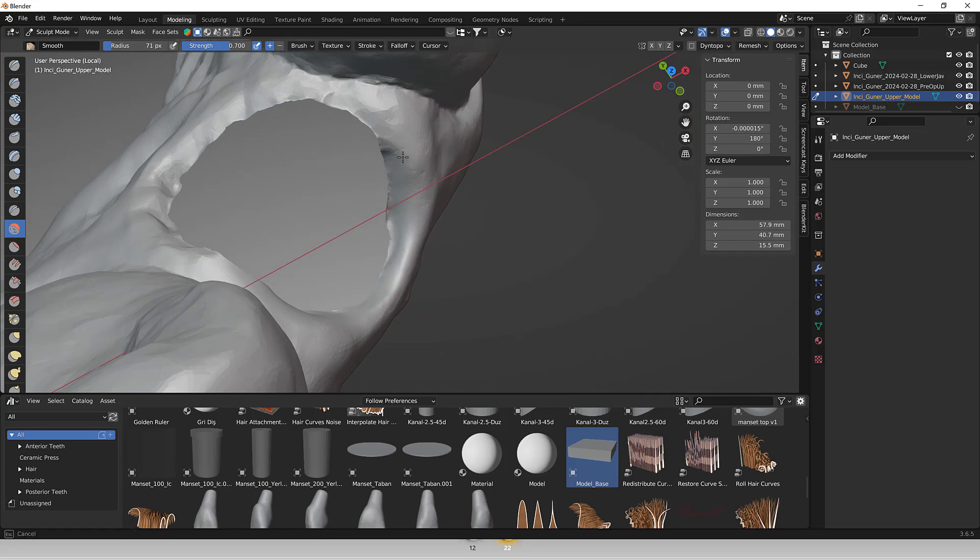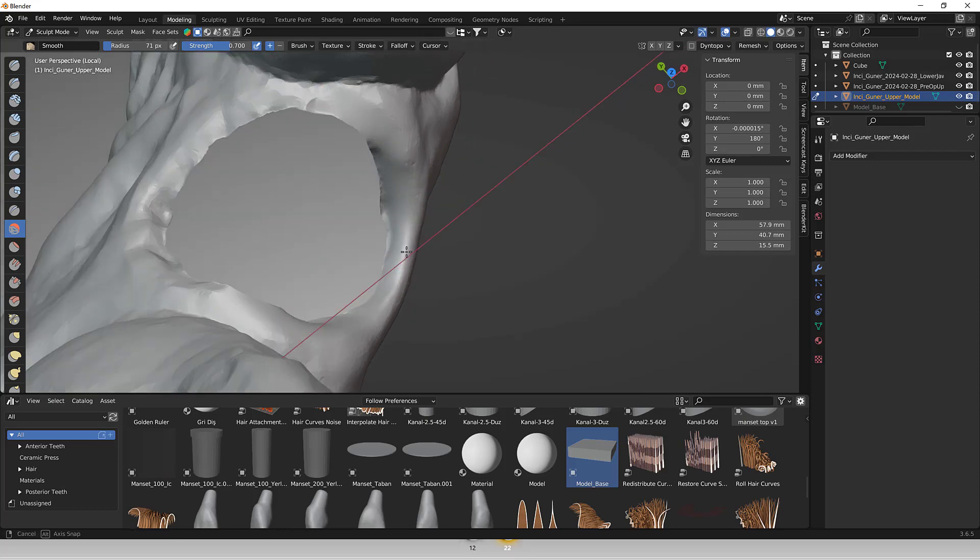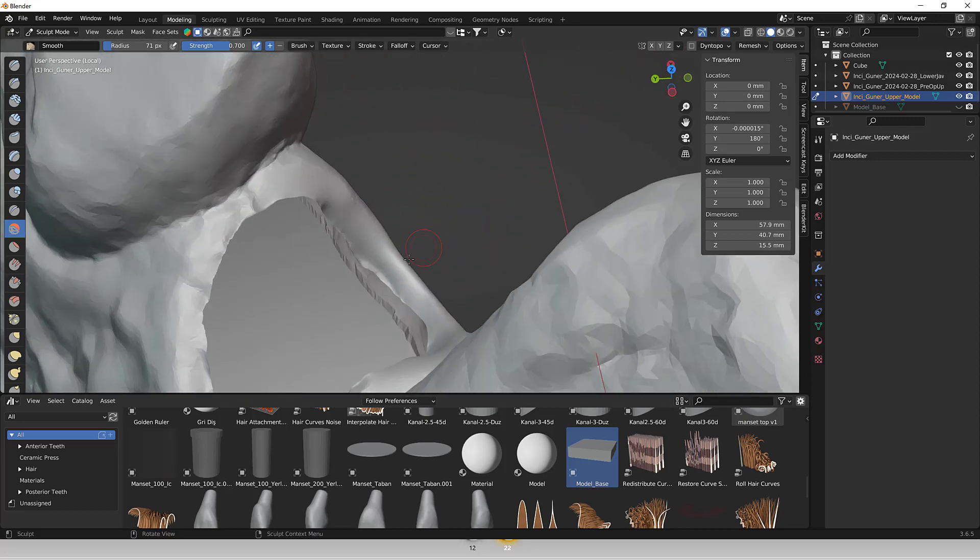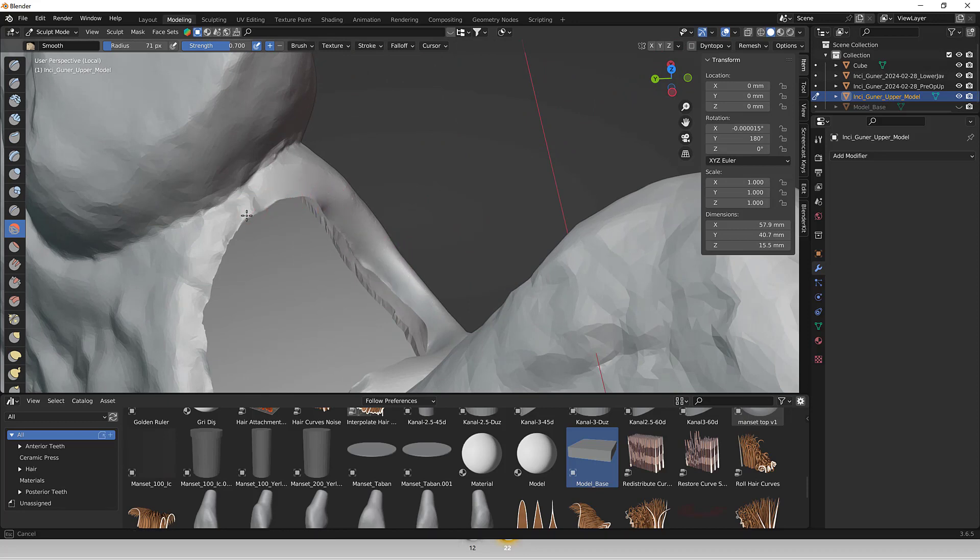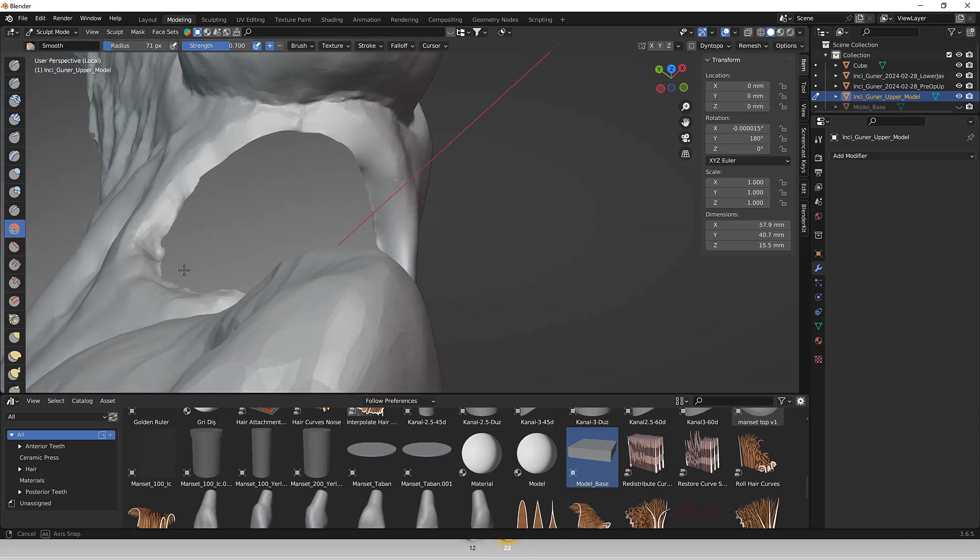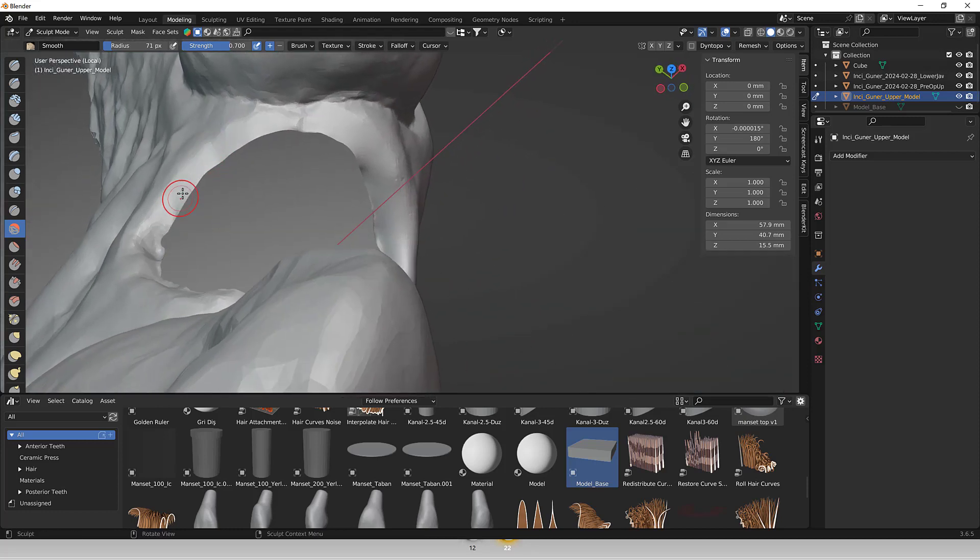Blender includes robust sculpting tools that allow users to sculpt and refine models with precision. This feature is particularly used for creating detailed dental anatomies or adjusting the shape and texture of the teeth and gums.